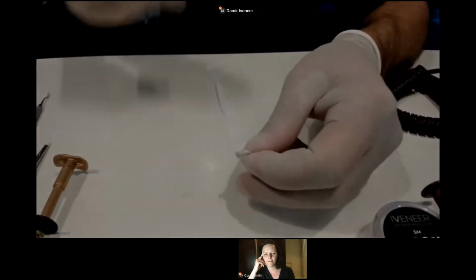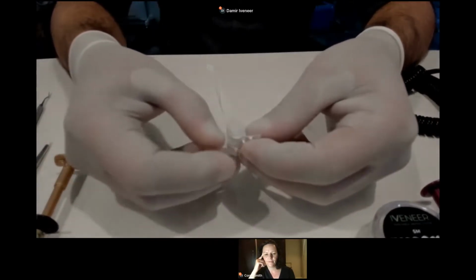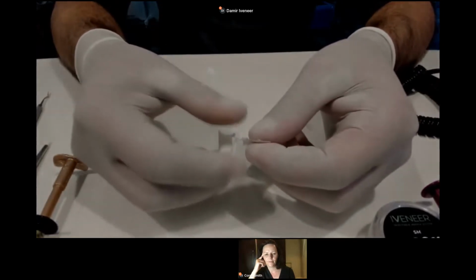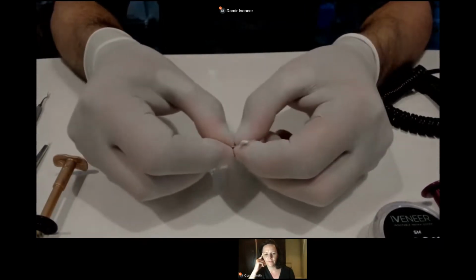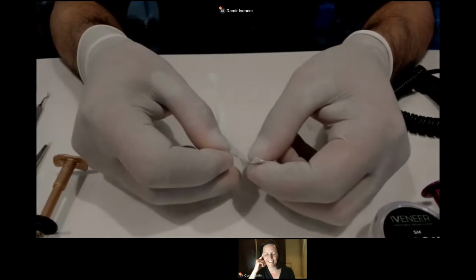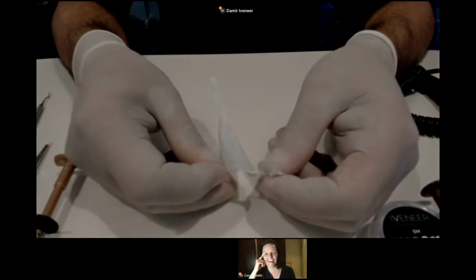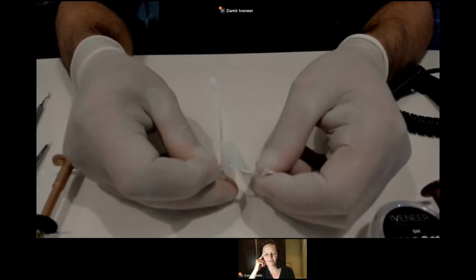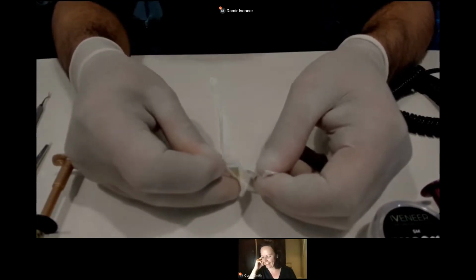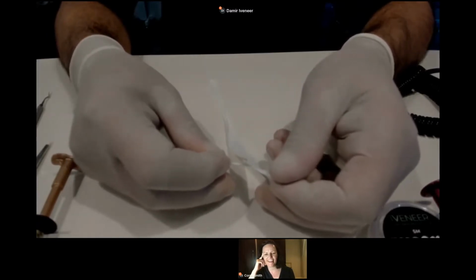I'm lecturing a lot in Israel, and I lectured in the Philippines now, and many of them ask me, don't you inject anesthetic when you do this Teflon retraction cord? And I say, never. Do you anesthetize when you put in a retraction cord? I don't think so. You know what will happen if you do the injection? The lips will fall, and while they smile, you won't be able to understand the correct architecture. So for me, it is a no. Don't inject. You don't need to.